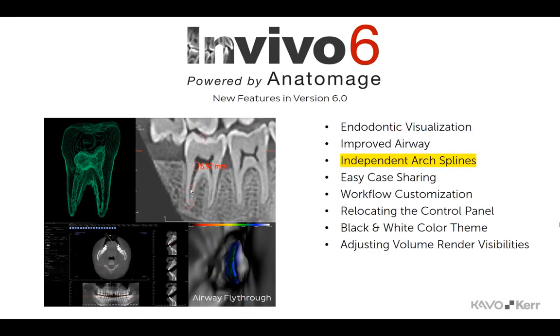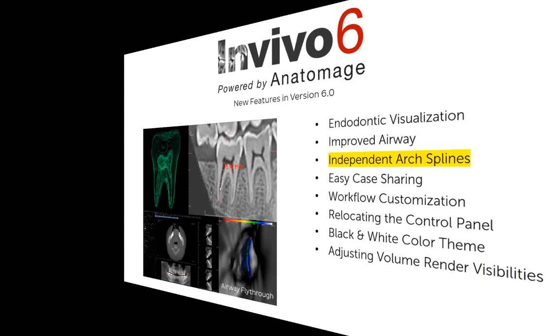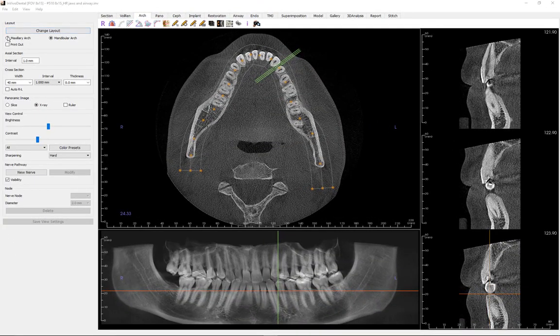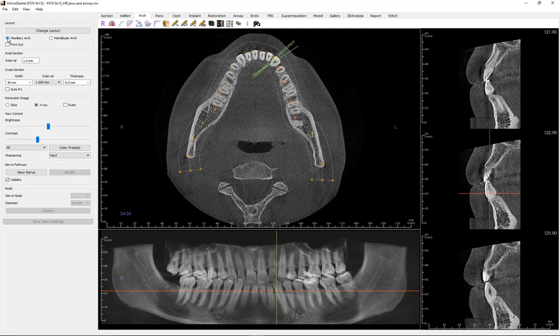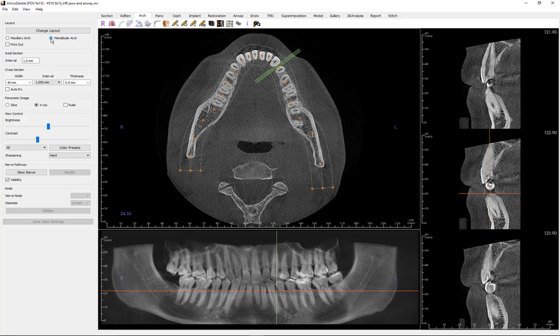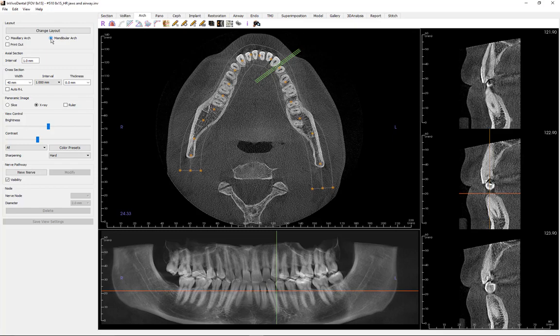With NVivo 6, the user can now build separate maxillary and mandibular arch splines, enabling the cross-section to be viewed more effectively. Maxillary arch and mandibular arch options allow two different arch splines to be created and saved. Switching between the two options changes which spline is manipulated and used in creating the panoramic and cross-sections.